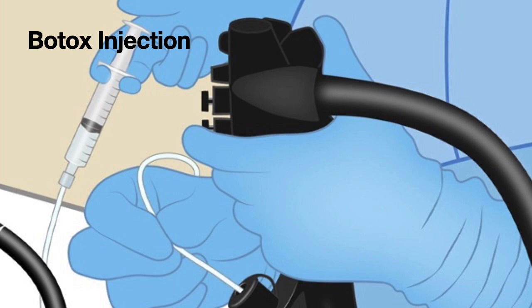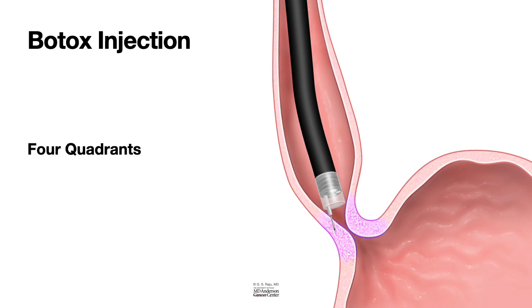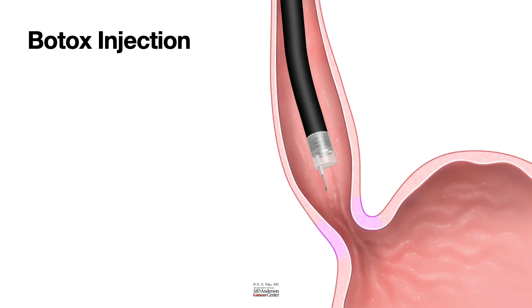Inject in small amounts: 0.5 ml, stop; another 0.5 ml reaching 1 ml, stop. Say it loudly — '10 units, 20 units' — because 1 ml equals 20 units. When you finish 1 ml, announce '20 units delivered.' We inject into at least four quadrants of the lower esophageal sphincter. With the injection, the muscle relaxes, spasm is relieved, and the lower esophageal sphincter opens up, allowing the patient to eat.